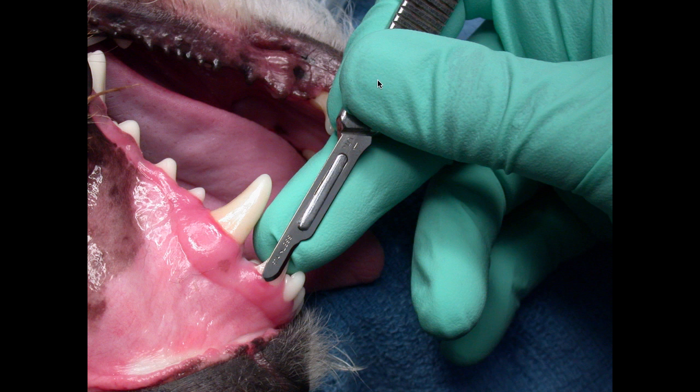I can use my forefinger and my thumb to make small little stab incisions into the gum tissue to advance that scalpel apically to the level of the bone. When making a flap, no matter where it is, I'm going to use little stab incisions so that I have complete control and I don't end up going through the attached gingiva. When we do our vertical releasing incisions, we can do a continuous pass of that scalpel, but when working on the sulcus or the gingival margin to release tissue, we want to make little stab incisions.